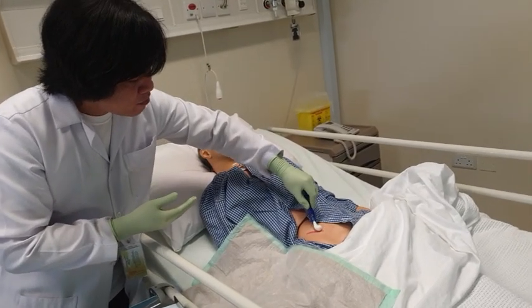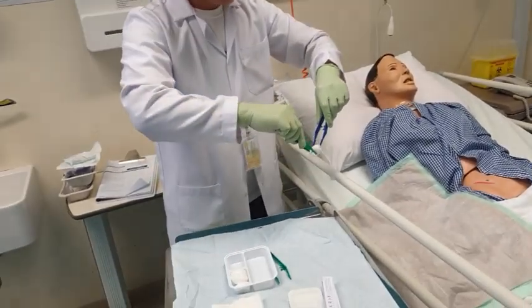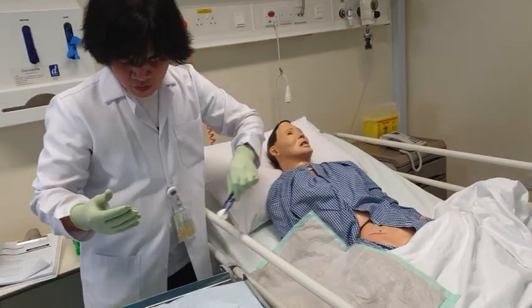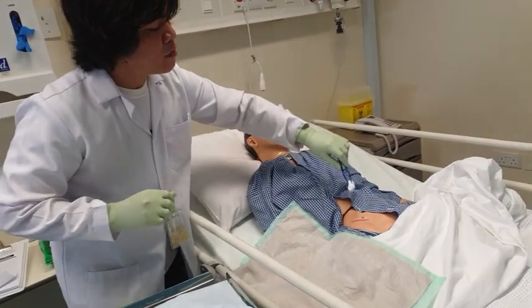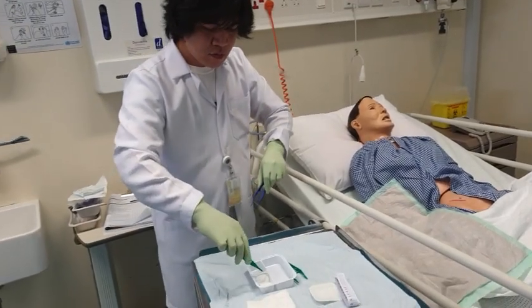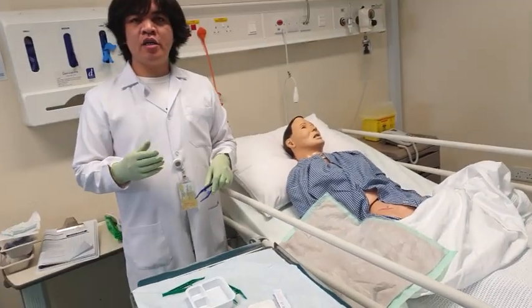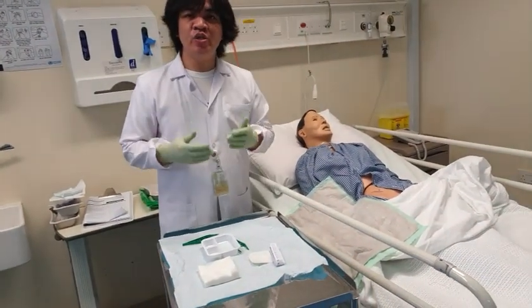Again, one direction. And then drop. Get another cotton. Pass it to the blue forceps. Go to the other side this time. One direction. Okay, drop. Get another cotton. Okay, one direction. Okay, so at this point, we have already cleaned the wound, so we can dispose this one. So at this point, we're going to dry the wound.